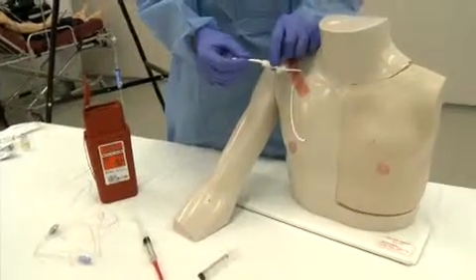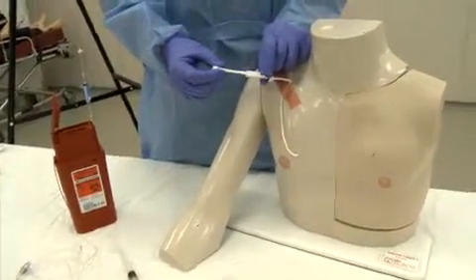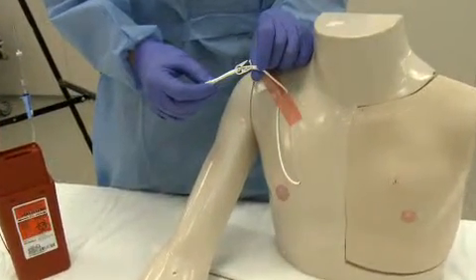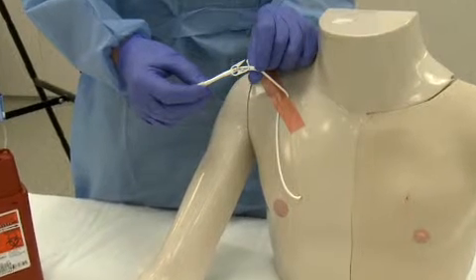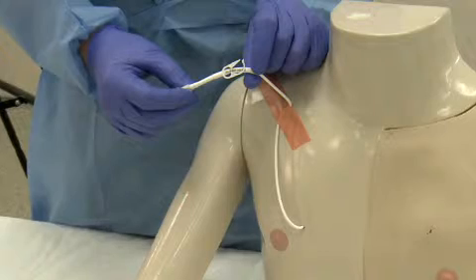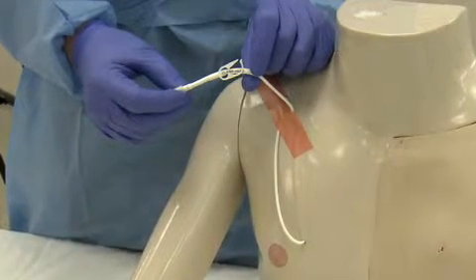Locate and expose the CVAD. This indwelling device provides IV access for long-term therapies. It is a closed system that is comprised of an indwelling catheter tube, an inline clamp, and a Luer lock access port with protective cap.